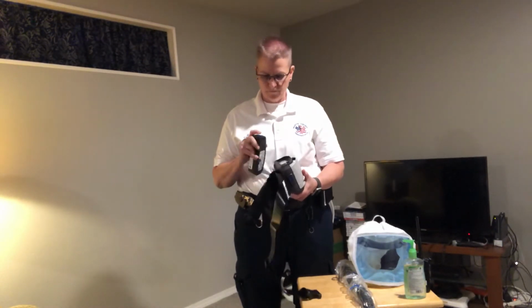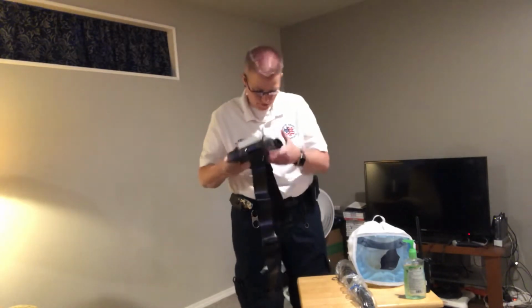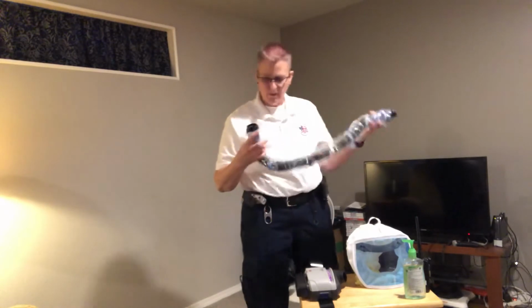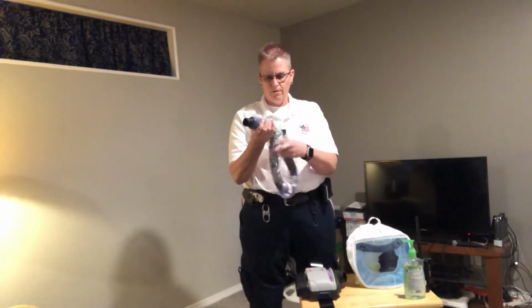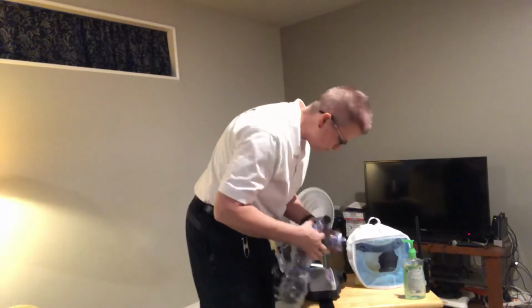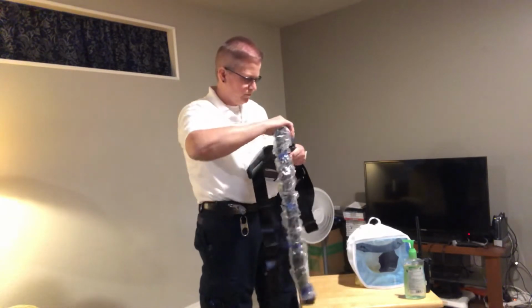Okay, so now that the battery has been tested, she's going to apply that battery. So the battery's in, sorry. Okay, oh, no, you're right. So what Jody just did, we just kind of skipped a couple steps, that's okay. She put the battery into the main unit. It just clicks right into the bottom. Real easy, plug and play, just like the life packs. You'll feel it click. You'll hear it click. There's a blue knob on the side to release the battery, as she's pointing out right there.